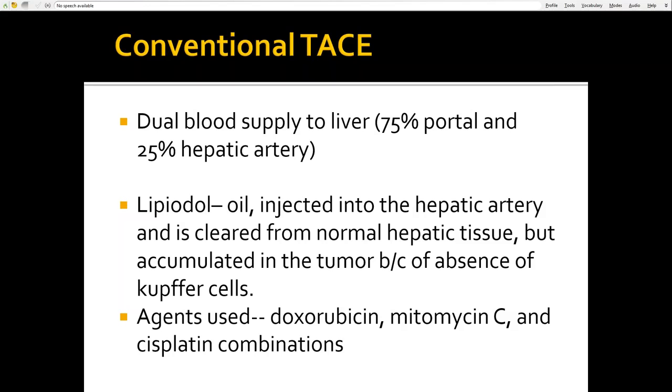But one nice thing about the Lipiodol is when you inject it, it outlines the tumor that you're trying to treat. And that can come in handy because in the future, if you wanted to ablate that particular tumor, then you see exactly the margins of it. So people are now, like myself, if we inject Lipiodol into the tumor, then after we do a conventional TACE, you can go back and ablate that tumor with the modality of your choice, microwave or RFA or whatever, and you get a double whammy that's basically trying to treat that particular tumor.